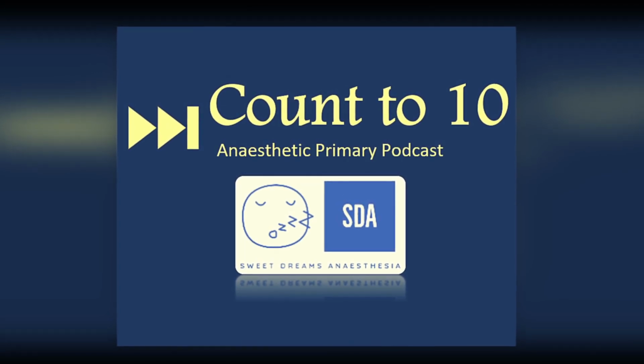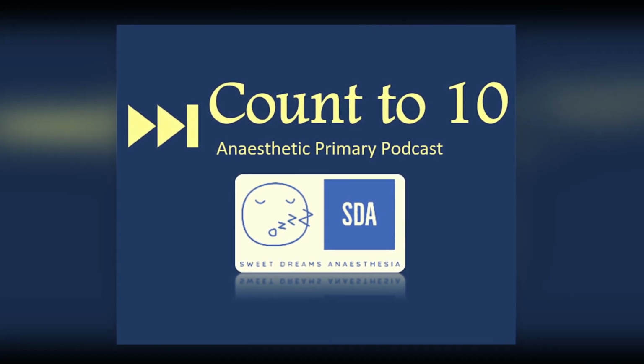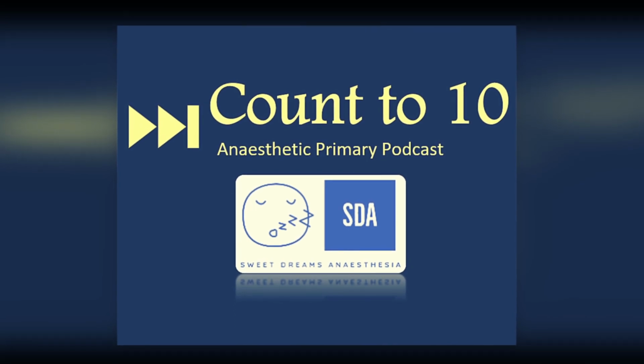The last weird question you might get asked is what is the isosbestic point? Now I've purposely left that to the end, and this just refers to the point at which absorption of a certain wavelength of light by two substances is equal. Simply put, this is where oxyhemoglobin and deoxyhemoglobin will absorb the same amount of red light and infrared light. These 2 points correlate to 590 nanometers and 805 nanometers. The clinical relevance of this, I would argue, is low, but in some instances, the isosbestic point does get used as a zeroing point to make sure the device is functioning appropriately.